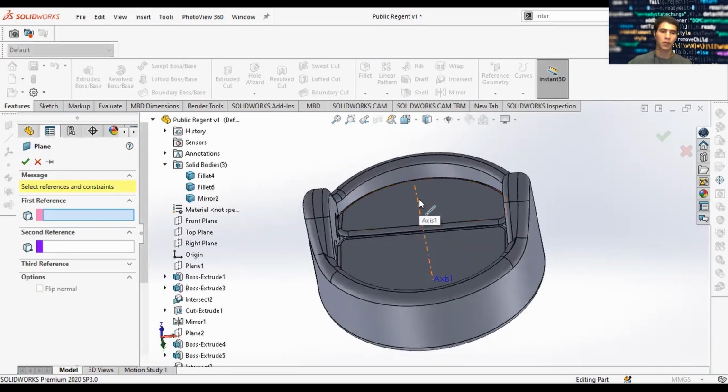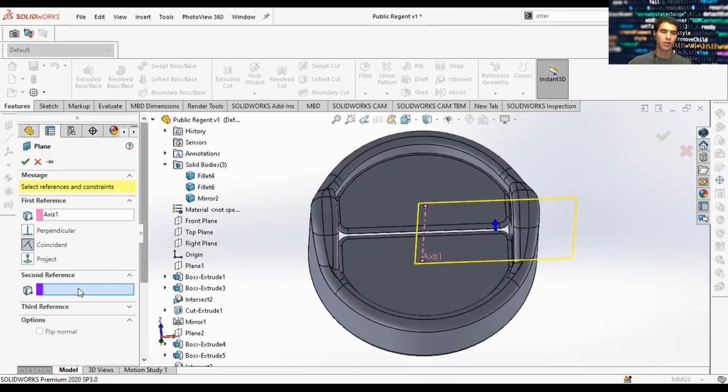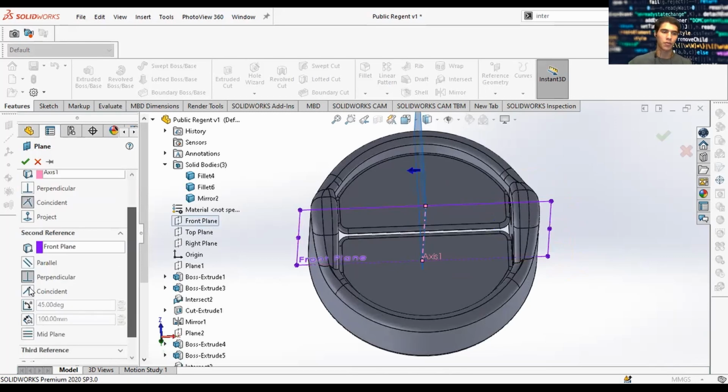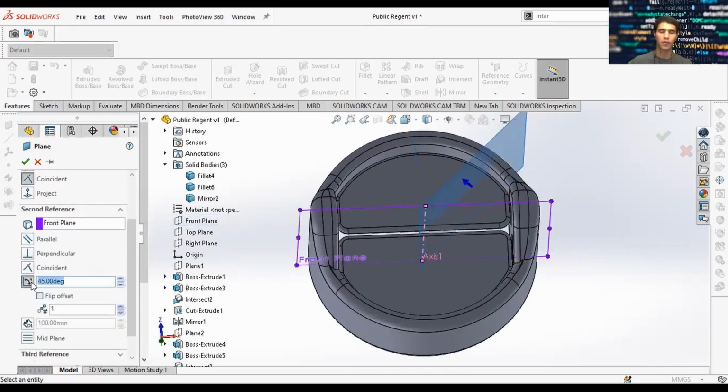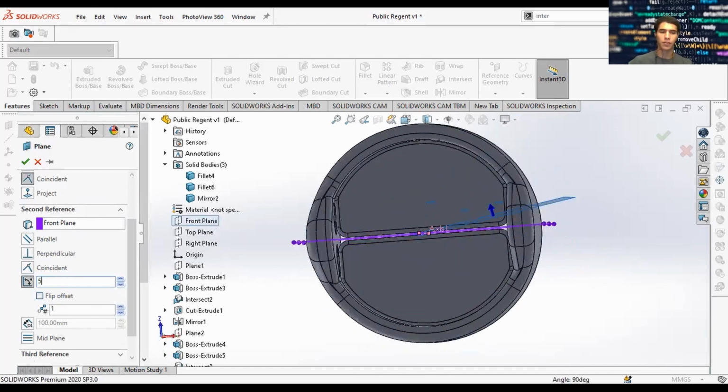So for example, for the first reference, it's a plane with the axis as a reference. And then for a second reference, I'll just use the front plane. And I can manipulate now the angle at which I want to have this plane. So I'm going to the calculator. 360 divided by 36, 10. So 10 degrees. And we'll go even smaller, we'll do 5 degrees. And approve this plane.